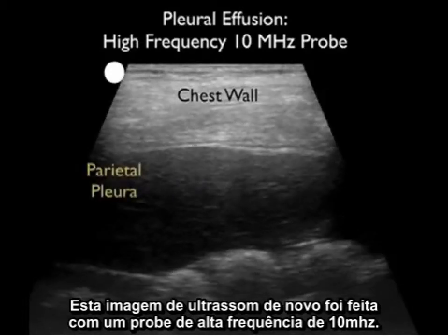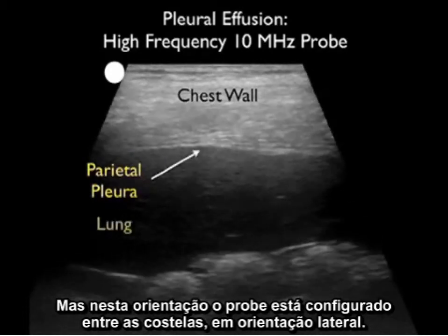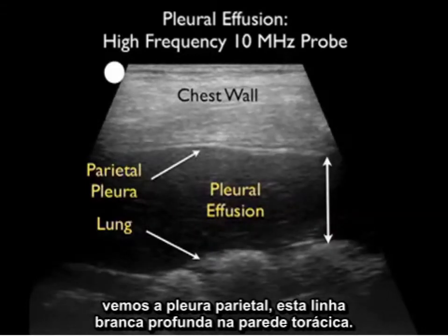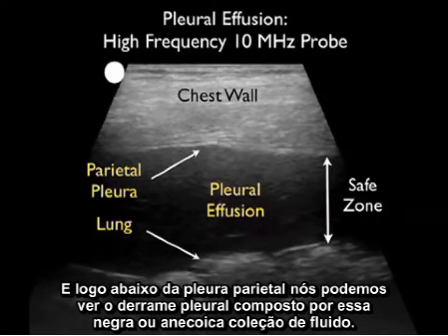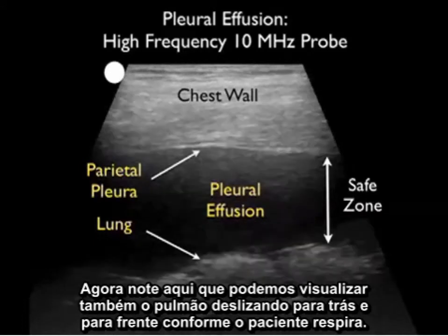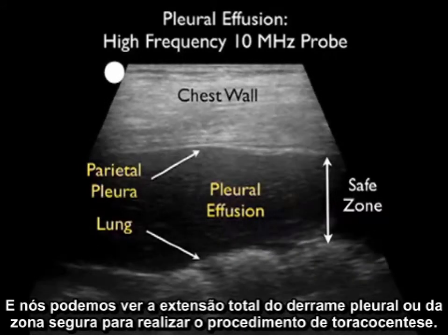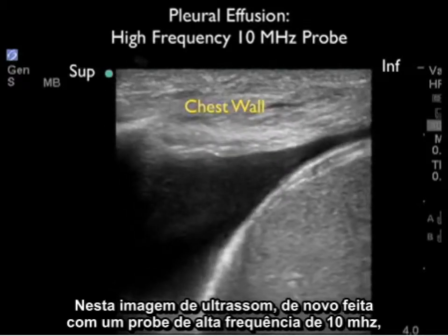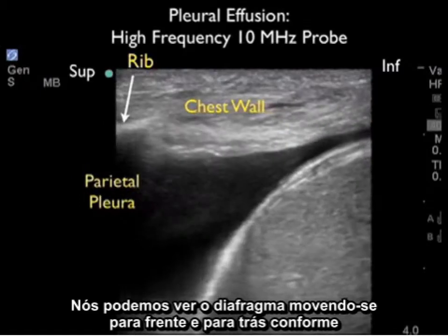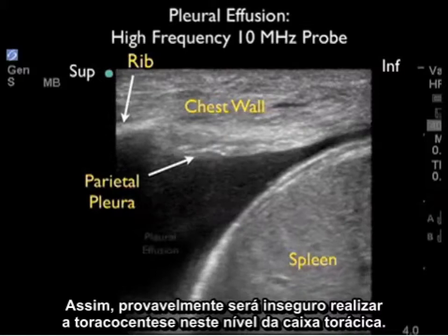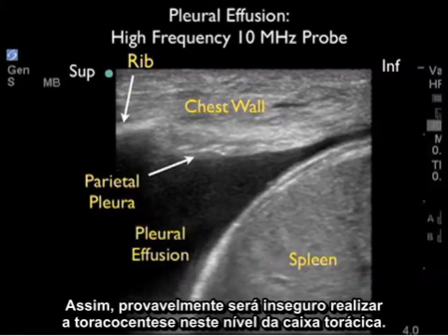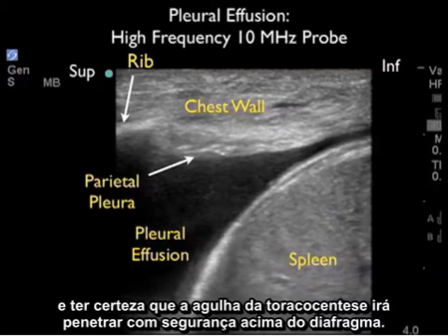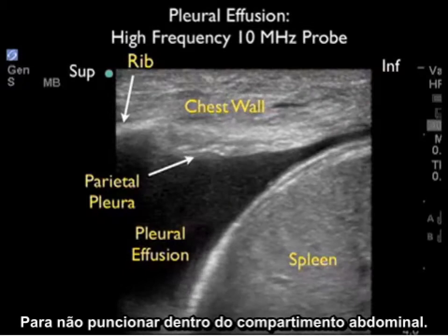This ultrasound image is again taken with a high-frequency 10 megahertz probe, but with the probe configured between the ribs in the lateral orientation. We see the chest wall anteriorly, the parietal pleura as a white line deep to the chest wall, and just deep to the parietal pleura the pleural effusion as a darker anechoic collection of fluid. We can also see lung sliding back and forth as the patient breathes, and the full extent of the pleural effusion defines the safety zone for thoracentesis. In the next image, we can see the diaphragm moving back and forth as the patient breathes, defining the lower aspect of the thoracic cavity. It would be unsafe to perform a thoracentesis at this level, as we might go through the diaphragm and into the spleen. So it's important to confirm the level of the diaphragm and ensure the thoracentesis needle goes safely above it, not into the abdominal compartment.